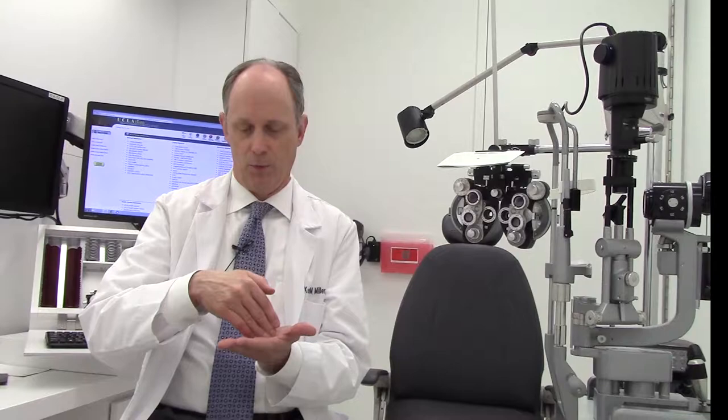Again, I like that footplate design. It's really sweet because it just slides on the conjunctival without binding or catching it. One of the things you want not to happen when you're using a diamond is you don't want to be moving it along the limbus and all of a sudden it catches and then you're pushing, pushing, pushing, but it's not going. All of a sudden it gives and you run through whatever's in front of the diamond.